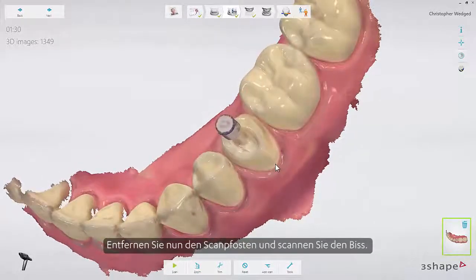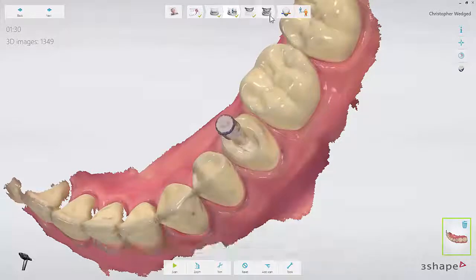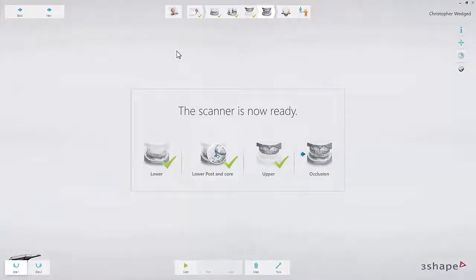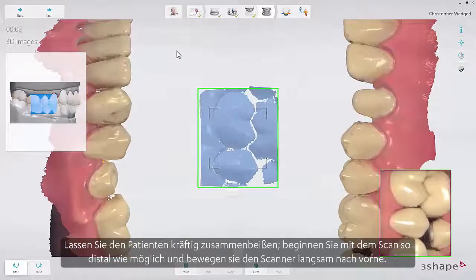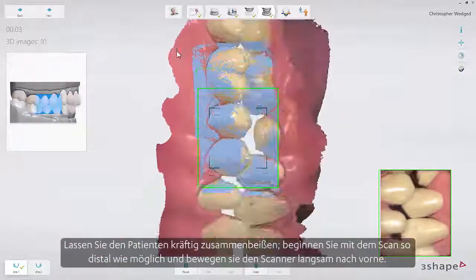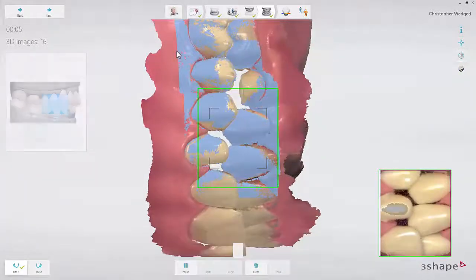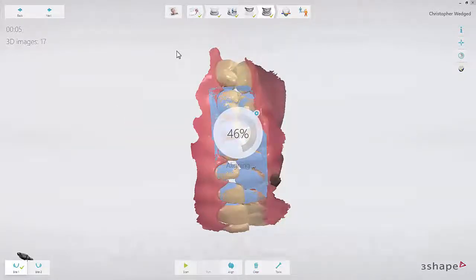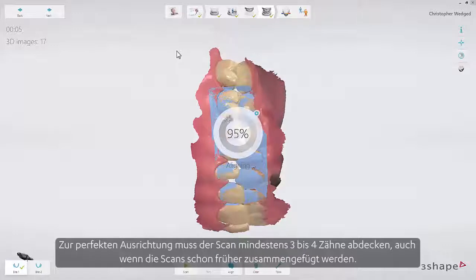Now remove the scan flag and scan the bite. Follow the software scanning tips for the best results. Ask the patient to bite firmly and start by scanning at the most distal position, moving slowly forward. Both scans will snap into position and the jaws are aligned. The scan should cover at least three to four teeth for perfect alignment, even if scans snap together earlier.